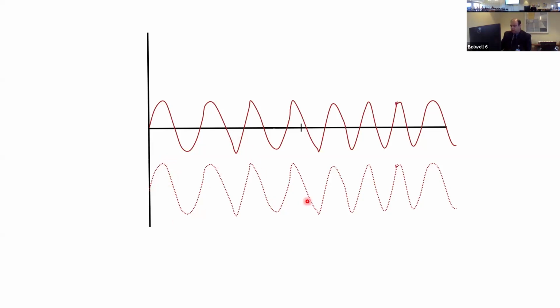Imagine this entire analog waveform made up of individual voltage points, these dotted things. If I'm not sampling fast enough, let's say I'm sampling only these points, then when I digitize the signal, the waveform is going to look like this. It's going to be connected to these voltage points. So this waveform is nowhere close to the original waveform. This is called aliasing.